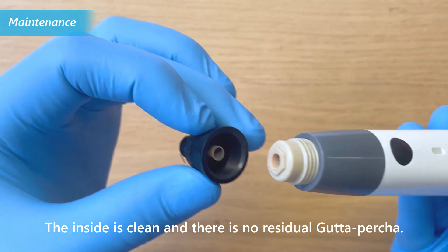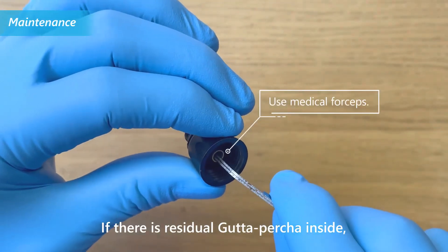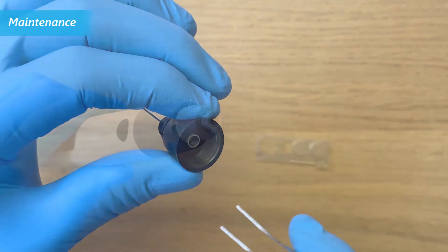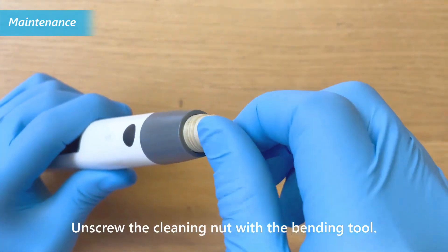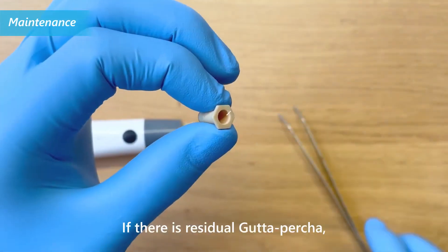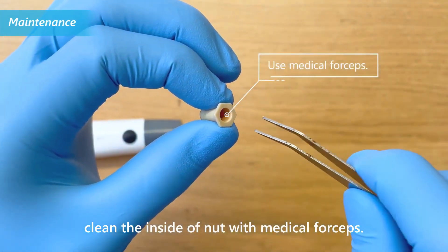Check that the inside is clean and there is no residual gutta percha. If there is residual gutta percha inside, use medical forceps to clean it up. Unscrew the cleaning nut with the bending tool. If there is residual gutta percha on the cleaning nut, clean the inside of the nut with medical forceps.